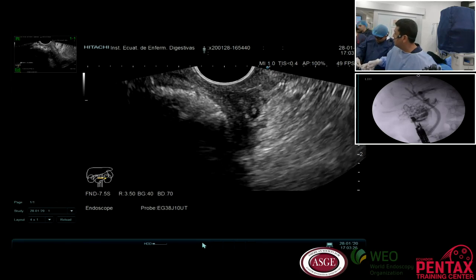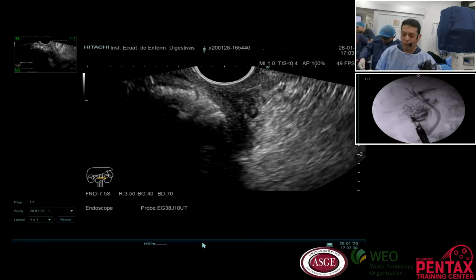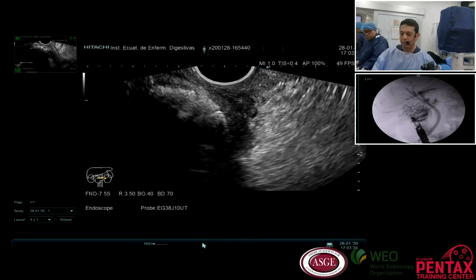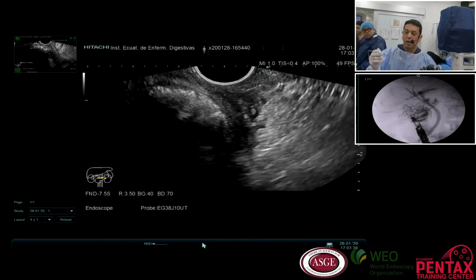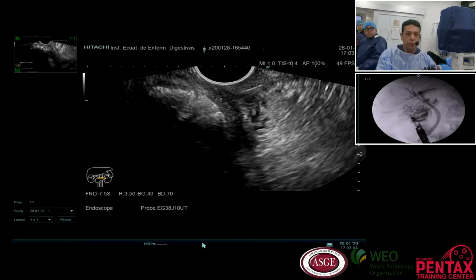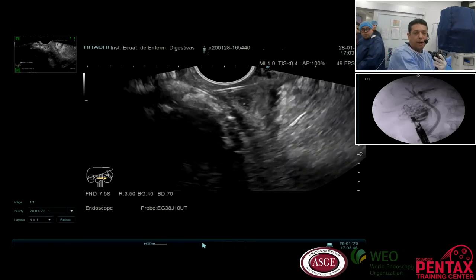¿Quién dijo eso? Bile. From where are you? In what country? So if you see at the end, this video will be available in a few minutes. So you can see again, we do a radio frequency of the bile duct.